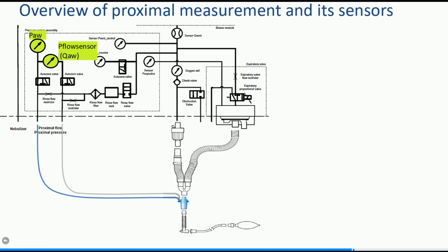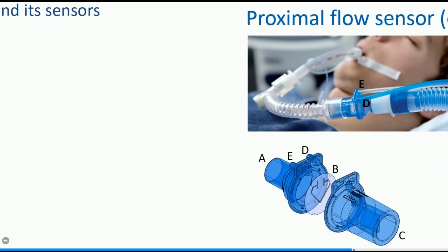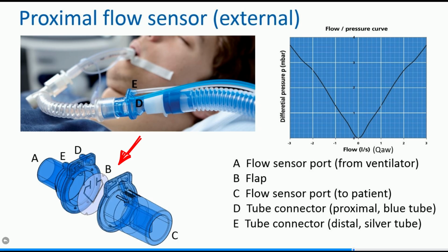The flow sensor contains a thin, diamond-shaped membrane within the outer housing that separates the distal and proximal pressure chambers. The membrane allows bidirectional flow through its variable orifice. The area of the orifice changes depending on the flow rate. It opens progressively as the flow increases, creating a pressure drop across the orifice.